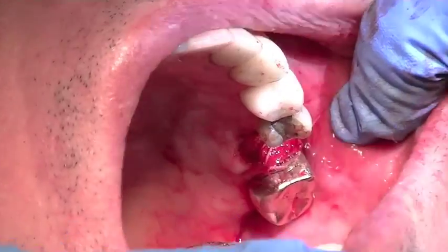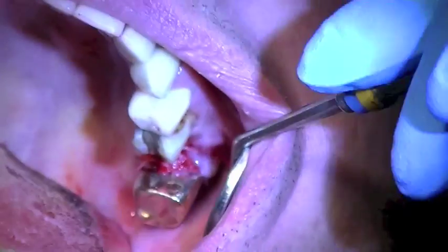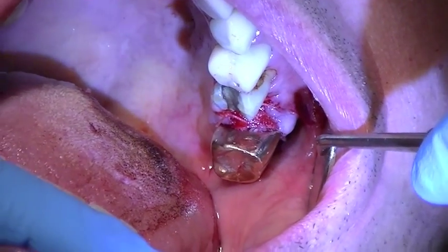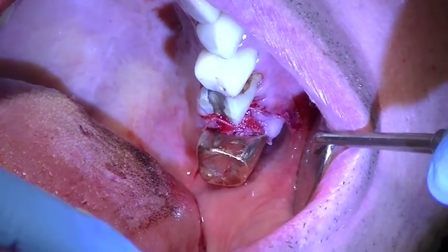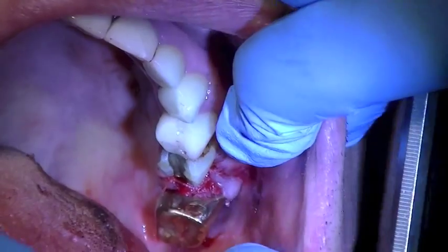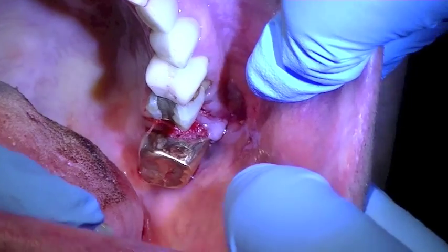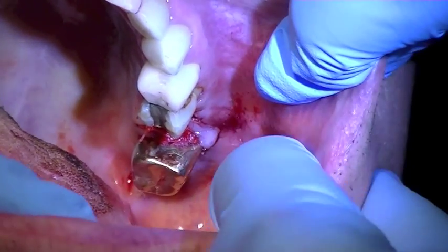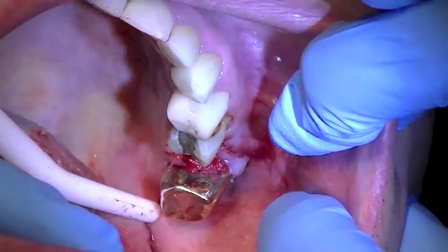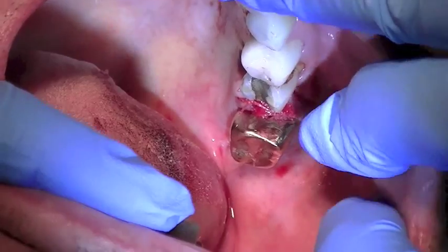I didn't want to pull too hard on that buccal, and we're going to place one more across. You can see that we've placed two cross sutures across the membrane. In positioning the sutures it's important — you can see I can pull here and tug — but the positioning of my sutures is such that when the patient goes to show his wife at home, the membrane and the connective tissue will all stay in place, so that's very important.